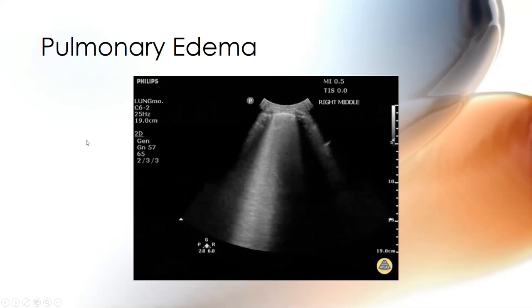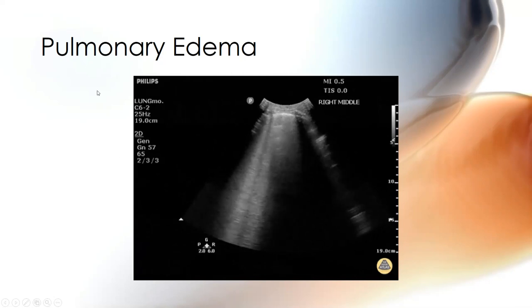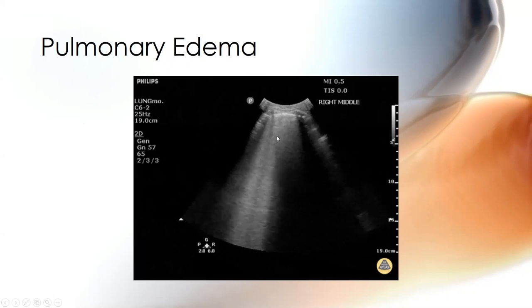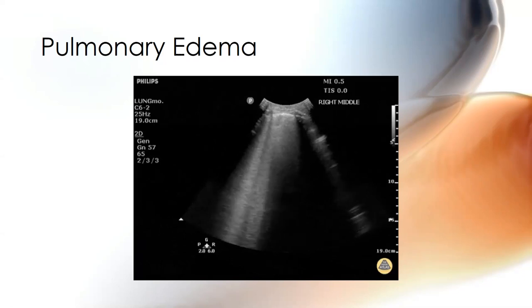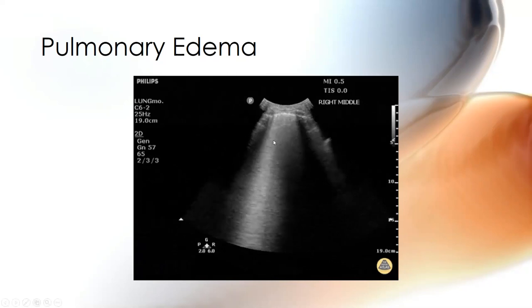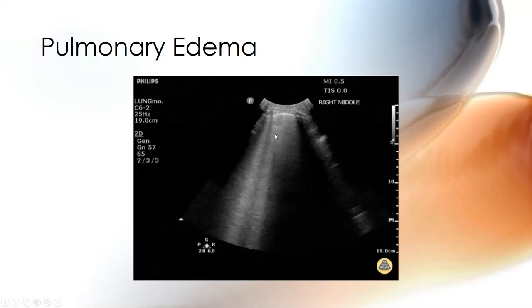With the clinical history that this person has pulmonary edema, I would expect to see this pretty much everywhere. Now, as the patient hopefully is getting better, you may see fewer lung zones with pulmonary edema, right? So the pulmonary edema will most likely hang around in the posterior lung bases. But somebody who's got horrible diffuse rales, you're going to see this anterior superior. And as this person becomes more euvolemic or drier as he's peed 10 liters, you should hopefully see this start to disappear.